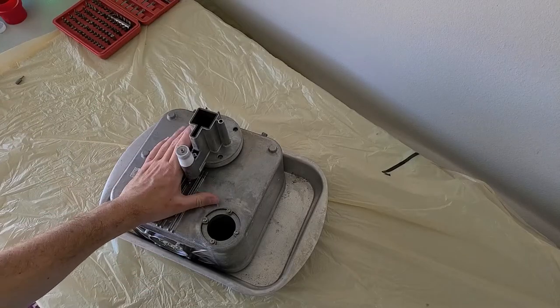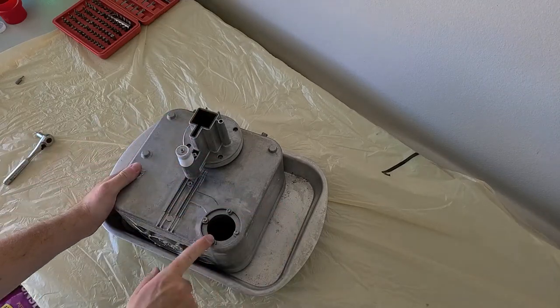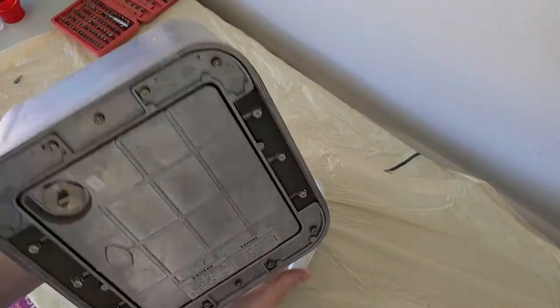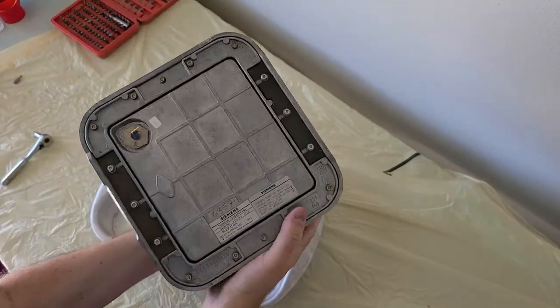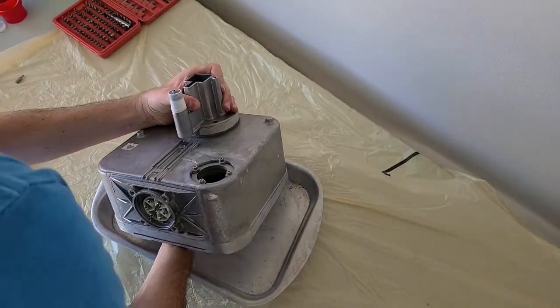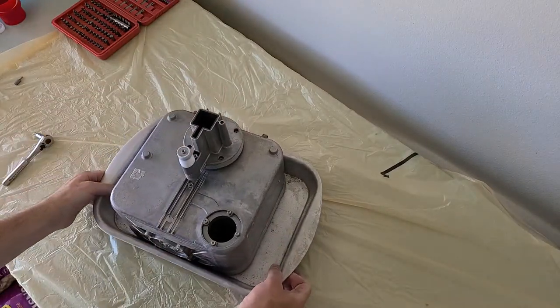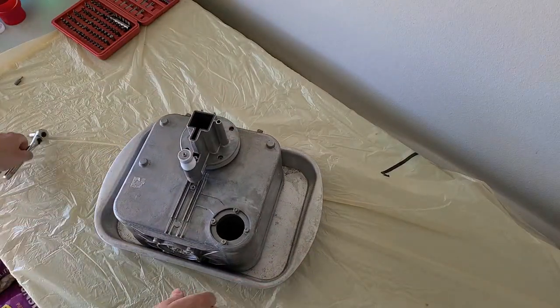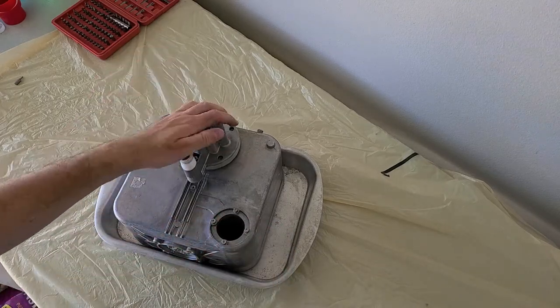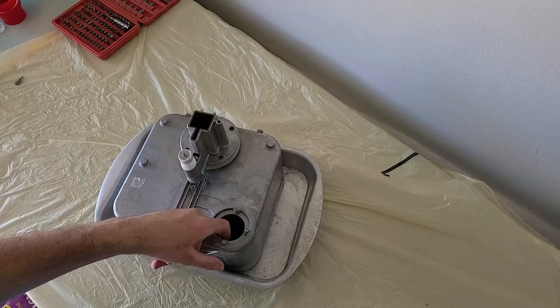Okay, I'm going to start taking apart the x-ray tube here. I'm going to start by taking out the oil first. That's probably going to be a lot. And then we'll take off all the other screws here. Hopefully this won't make a big mess. We'll see. On the prior x-ray tubes, the oil is always the messiest part of it. So I could go a few ways. I could take this off and get the oil out or I'm just going to take out the bellows tube here.